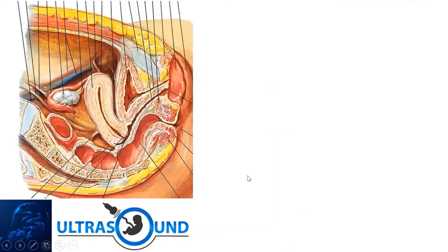Okay. So this is a picture to explain why we need to put a patient with a pillow, especially when we are scanning a patient with an anteverted uterus. Anteverted uterus means that the uterus is deflected to the front. A lot of people thought that you put your probe inside the vagina and go straight 90 degrees inside. It's actually not correct.